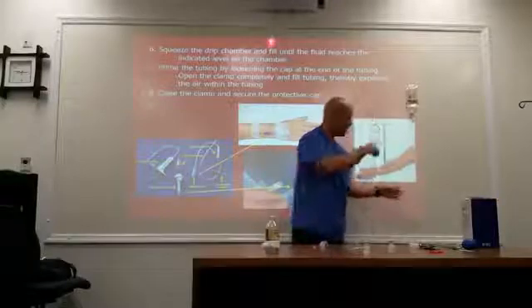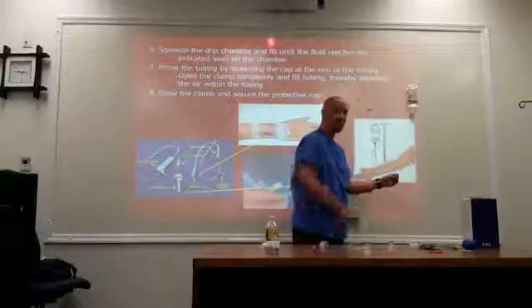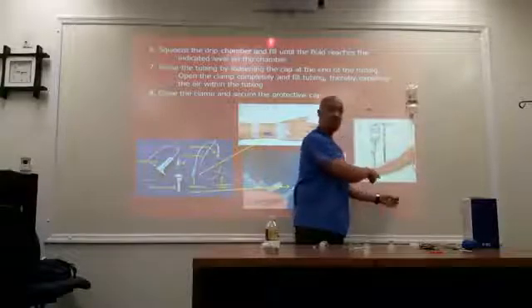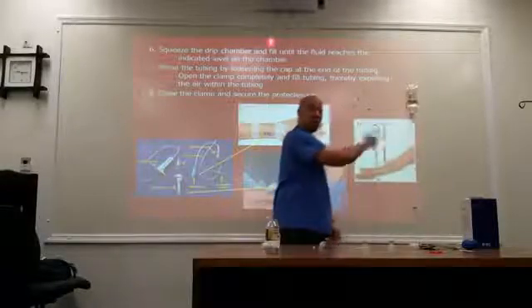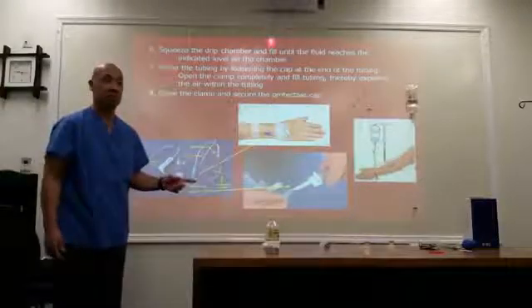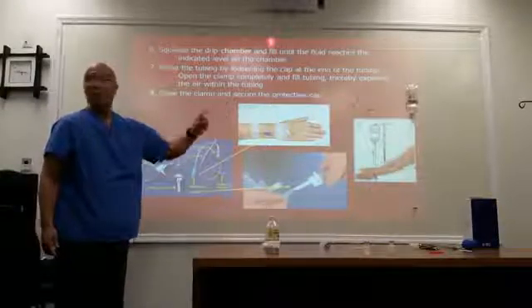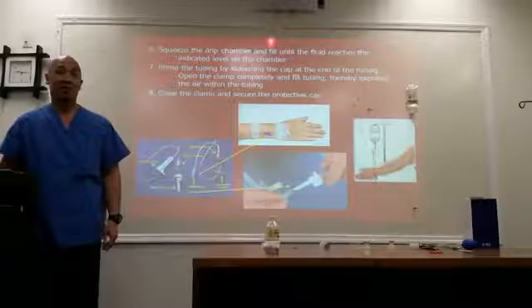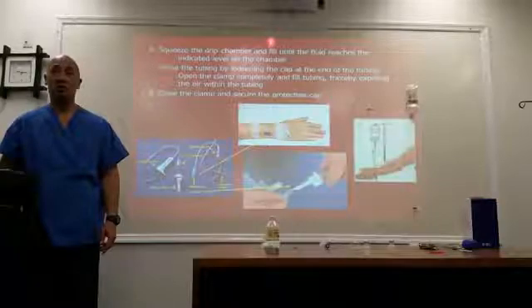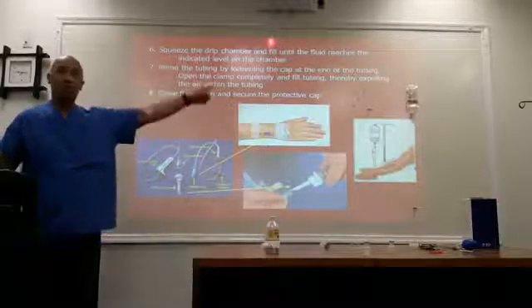Don't have the contrast flowing until the doctor says it's okay. So you want to lock it, but you can connect it. Make sure it's fluid on fluid, and then you can lock it so nothing's flowing in until the doctor's there to observe the contrast going into the patient. I just showed you guys the drip infusion method.